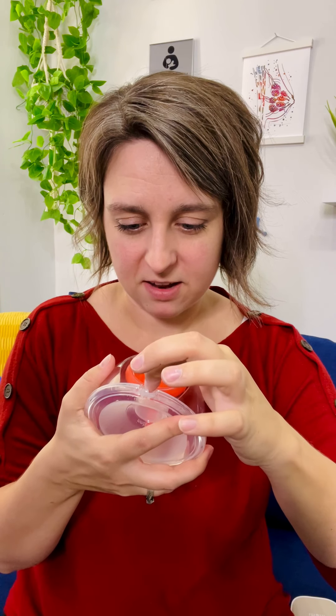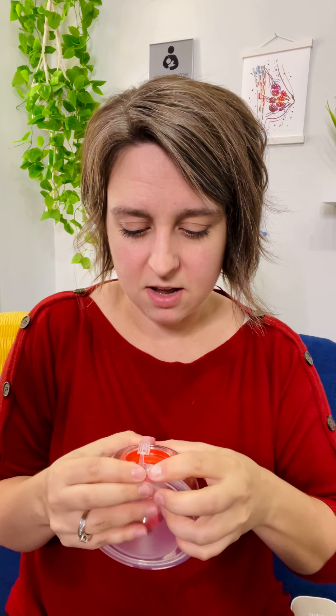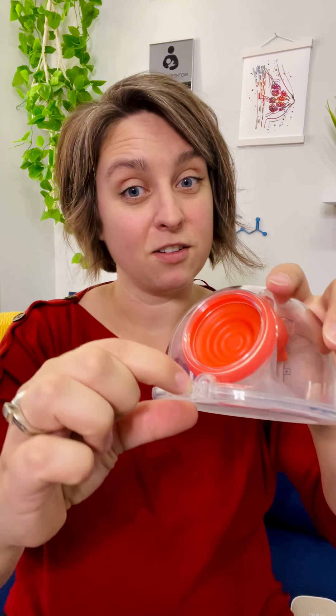It also has a valve on the top. I did a couple of suction tests today. When I had the valve open or just placed on there, the suction was good. If I shoved it all the way down, it actually affected the suction in a negative way. So just place it on top there. That's going to make it pretty leak-resistant — it's definitely not fully leak-proof, if you bend way over you'll still get milk out, but there's not an open hole, which is kind of cool.